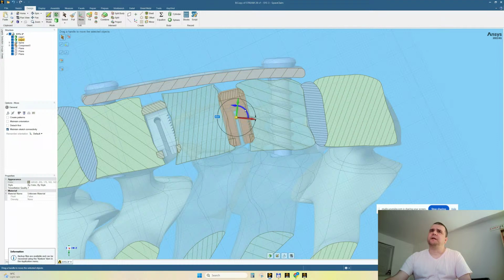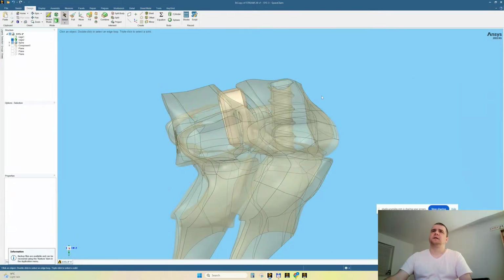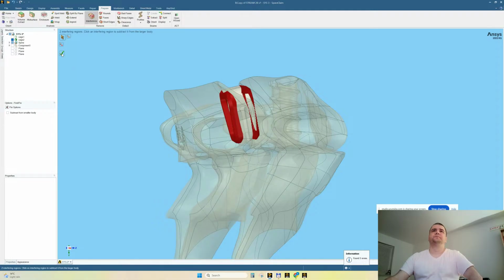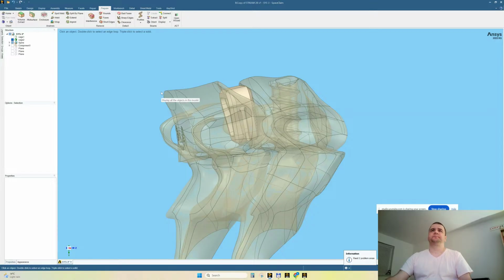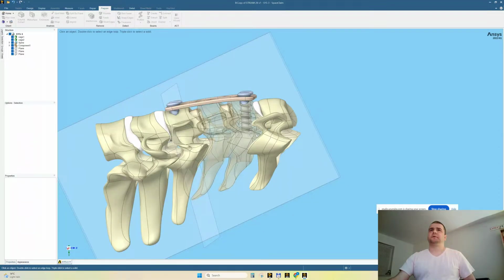Yes, we're rotating here, and it's nice. Let's keep only these three parts, hide others, and we're running the interference command. All right, now right click, save. When saving the entire project, it saves also the 3D model. And let's go for interference. We should have no interference.